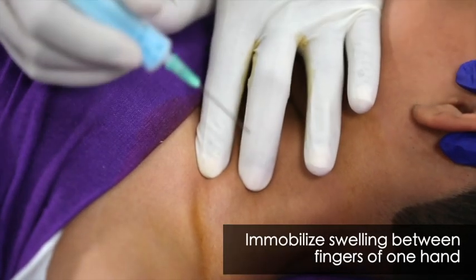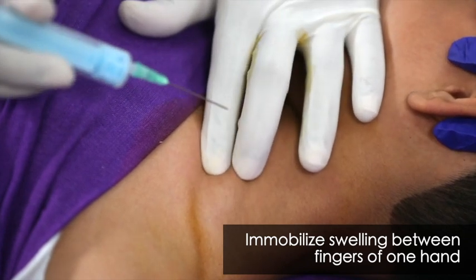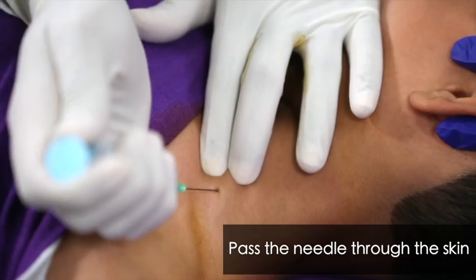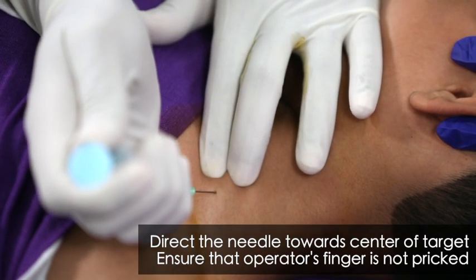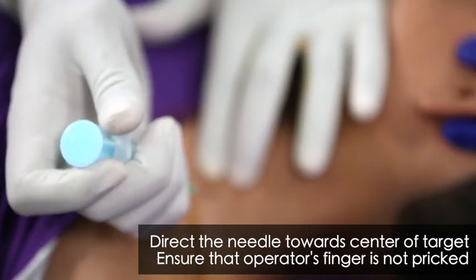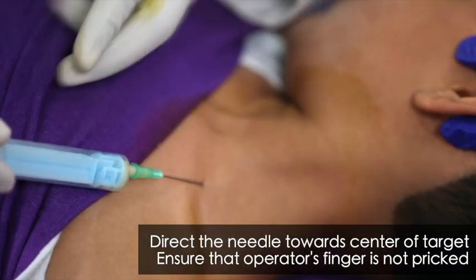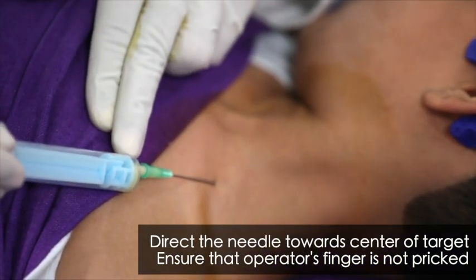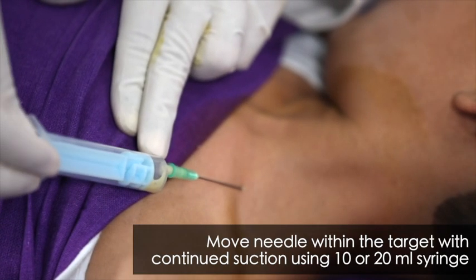The swelling or lymph node should be immobilized between the fingers of one hand. Pass the needle through the skin, avoiding any superficial veins. Direct the needle towards the center of the target. Precautions must be taken to ensure that the needle tip is not pointing towards the operator's fingers immobilizing the lymph node or deep structures below the node.